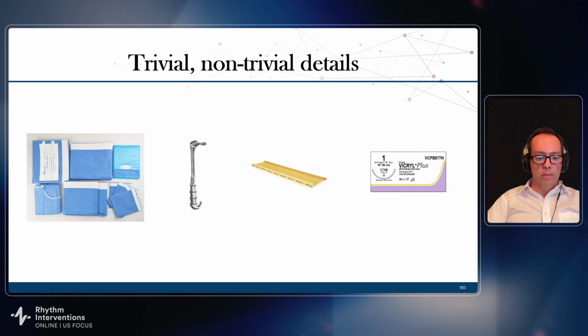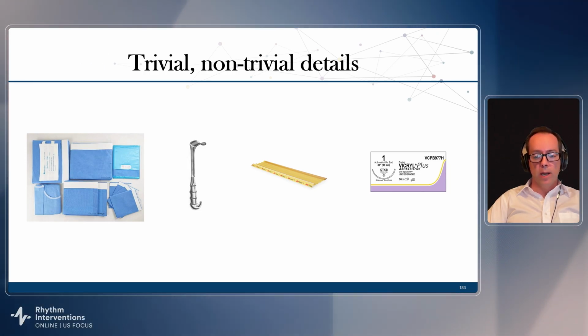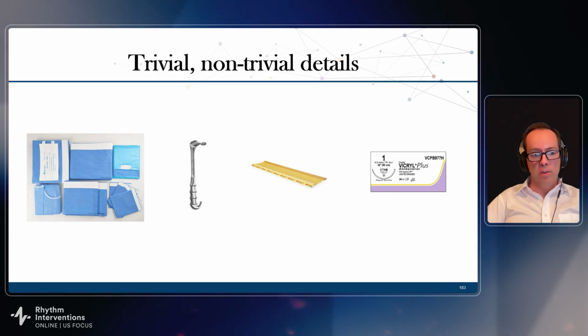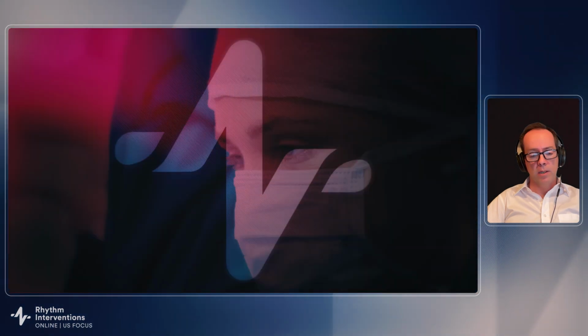The other tool to its right is the medium to large Richardsons. These retractors don't come in our pans, but they're actually about the width of the pocket you want to make for the SICD. This tool helps get in front of that belly of the latissimus dorsi and has been very instrumental in helping us dissect and get into the right fascial planes.